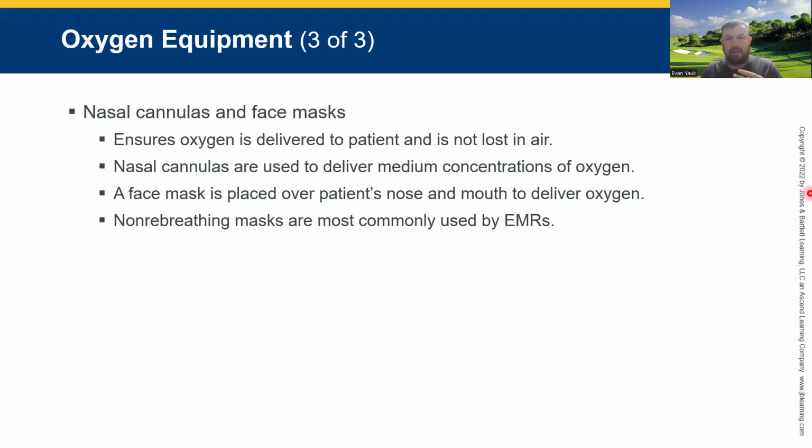So a nasal cannula gives you a certain percentage of oxygen. The face mask is a certain percentage of oxygen, and the non-rebreather a certain percentage. Right now, sitting here talking to you, I am breathing 21% oxygen in the air. So that's what everyday oxygen level is, 21%.